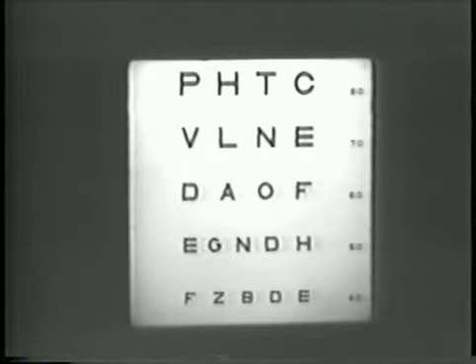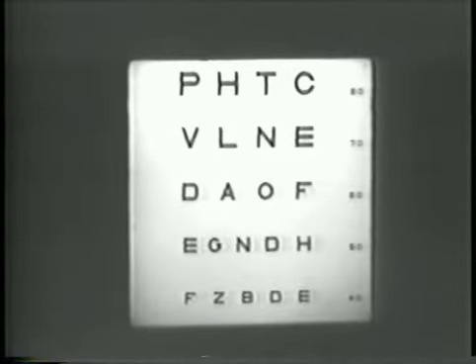When the cross cylinder is then removed, each point on the letter chart becomes a clear point focus on the retina. The strength of cross-cylinder testing lies in the two-choice balance between the two flip positions, an easy task for the patient. Now the circle of least confusion, or the point of best focus, must be maintained on the retina by proper sphere adjustment during cross-cylinder testing.